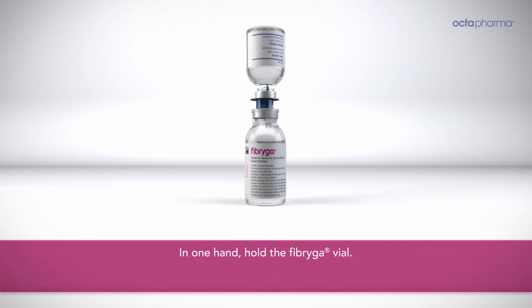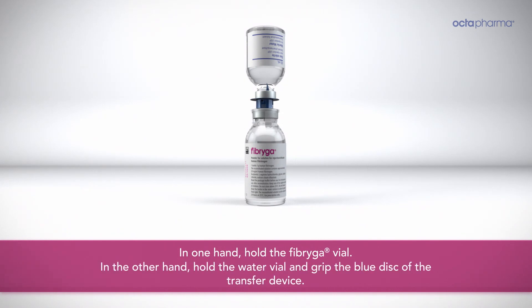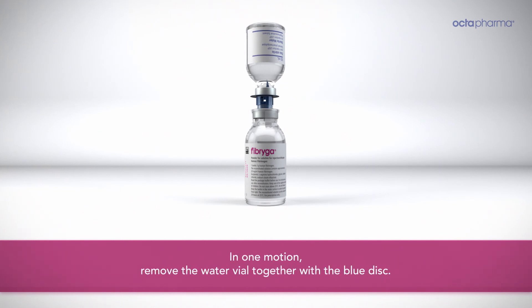In one hand, hold the Fibriga vial. In the other hand, hold the water vial and grip the blue disk of the transfer device. In one motion, remove the water vial together with the blue disk.